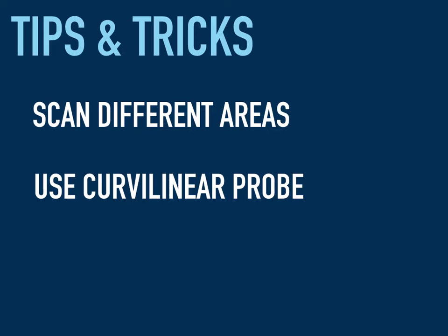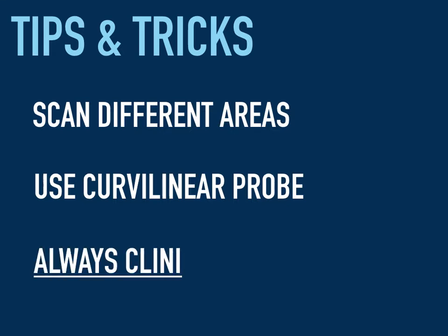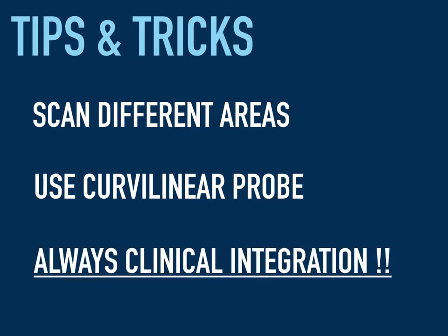Never use ultrasound, especially lung ultrasound, but any kind of point of care ultrasound, in isolation. You need to combine a classical approach with clinical information, with your clinical differential, with the image you obtain using lung ultrasound, and you will never miss a diagnosis.